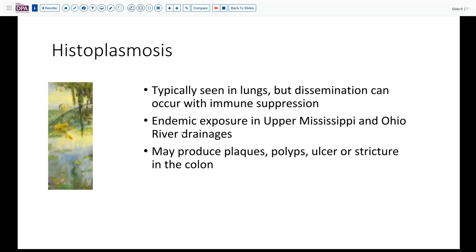This is a fungus that is endemic particularly in the upper Mississippi and Ohio River drainages in North America. It's not typically seen in Africa or South America unless individuals have had a prolonged period of residence in these areas, where they may have been exposed and developed a subclinical, contained infection within their upper respiratory tract. Upon development of immunosuppression, it can then disseminate and involve the colon or other disseminated sites. In the colon, it can be fairly subtle — sometimes just producing a mild plaque or even no finding. Occasionally histiocytes will aggregate to form a polyp, or there may be ulceration or even stricture formation.